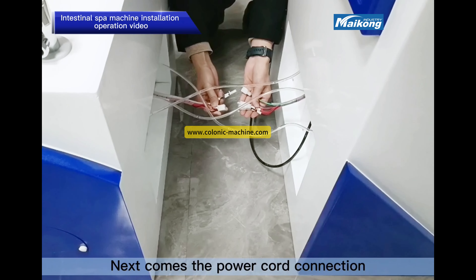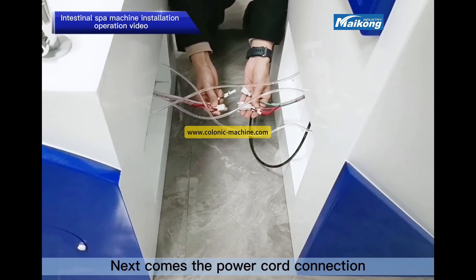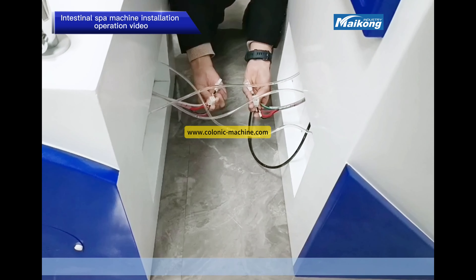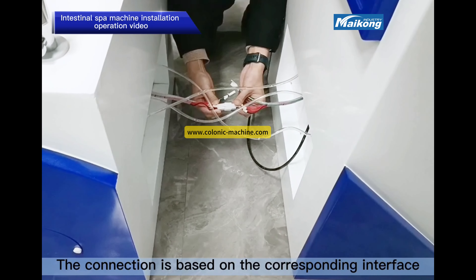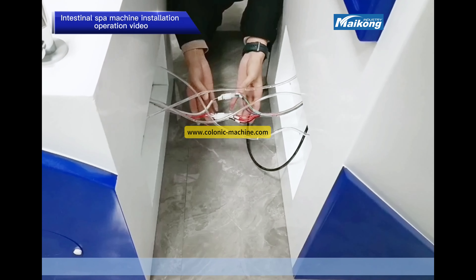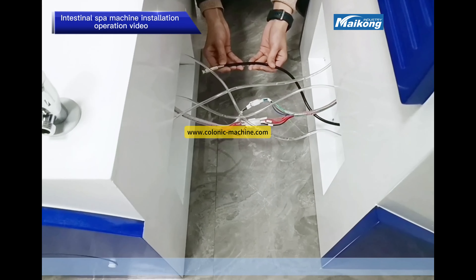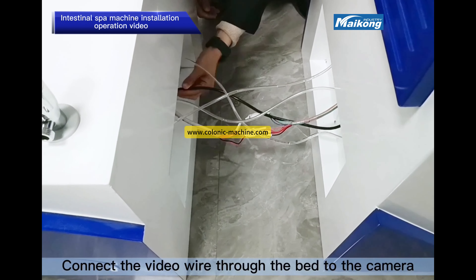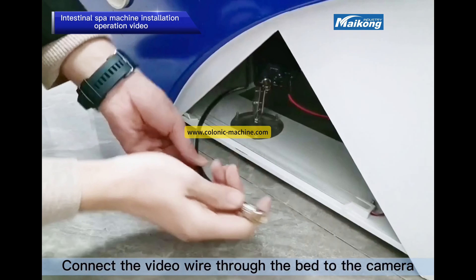Next comes the power cord connection. Connect based on the corresponding interface. Then make the video wire connection — connect the video wire through the bed to the camera.